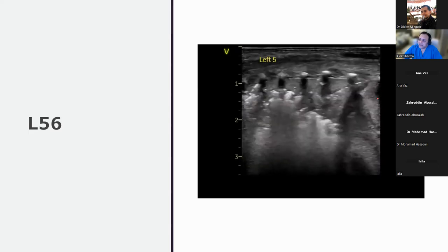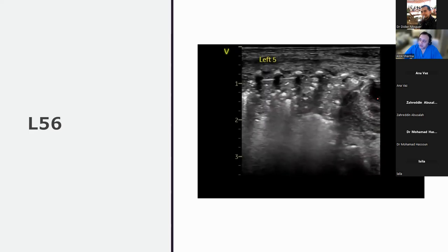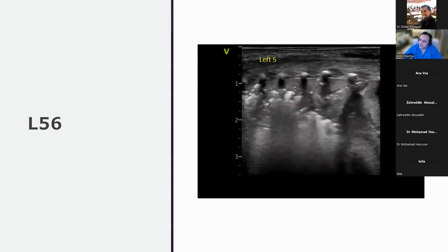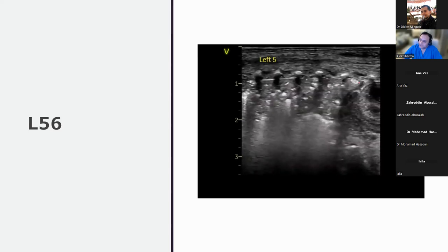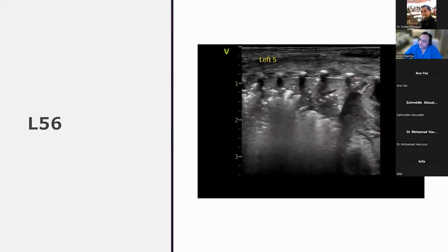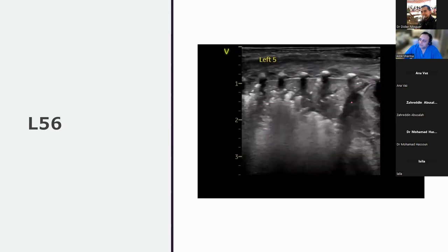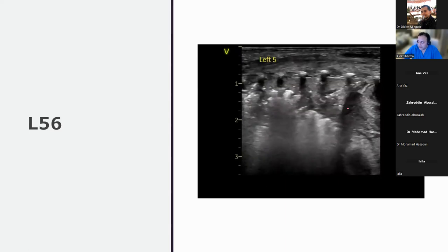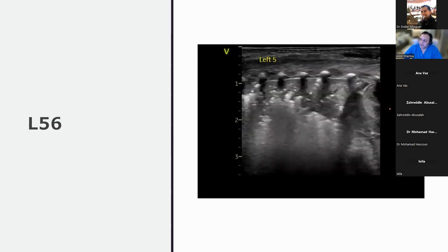And this is L5, L6. And can you see the same pattern that you saw in R5, R6? See that? This is complete lung atelectasis. Okay. Can you see the sickle-shaped zone? Yeah. This is complete atelectasis. I'm not convinced this is fluid over here. Can anybody tell me anything else?